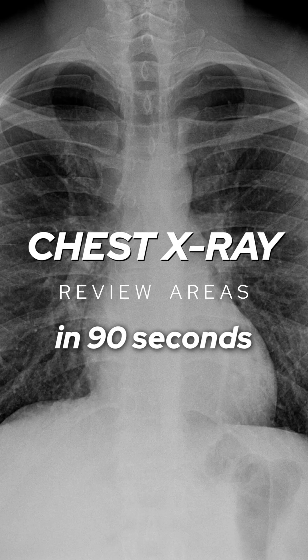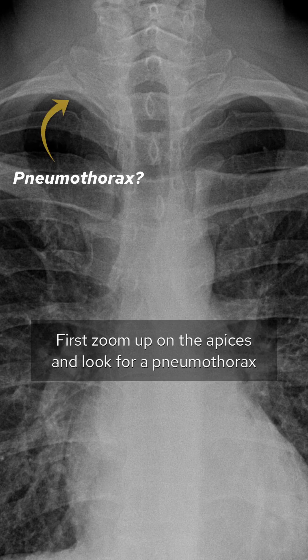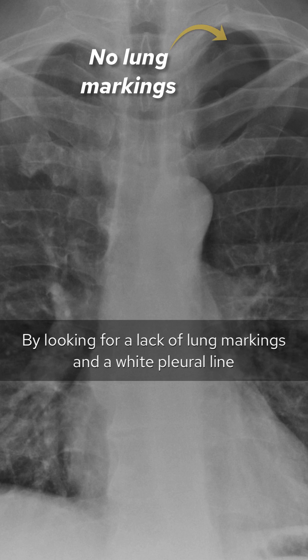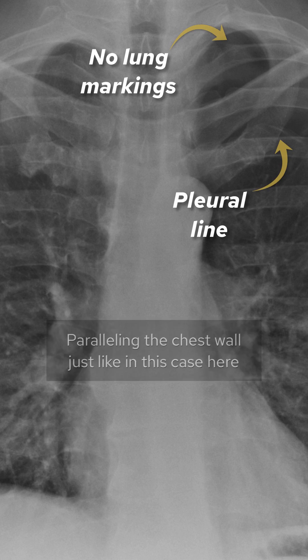Chest x-ray review areas in 90 seconds. First, zoom up on the apices and look for a pneumothorax by looking for a lack of lung markings and a white pleural line paralleling the chest wall, just like in this case here.